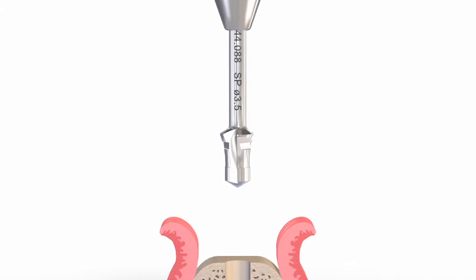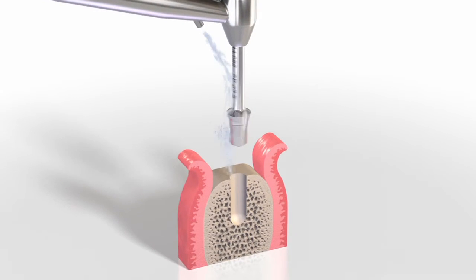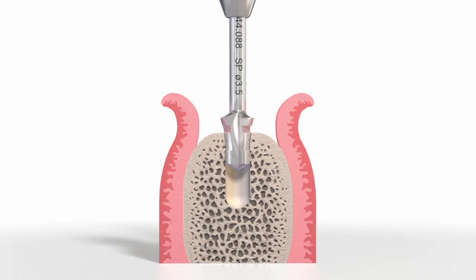The diameter indicated on the SP profile drill corresponds to the diameter of the guide cylinder, and therefore to the diameter of the implant bed before profile drilling. The Standard Plus profile drill is inserted according to the planned insertion depth of the implant.